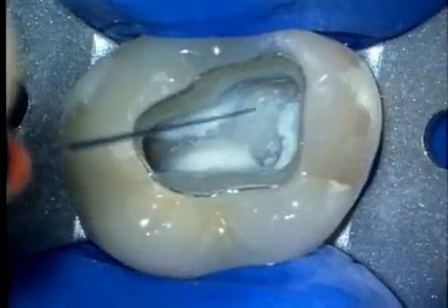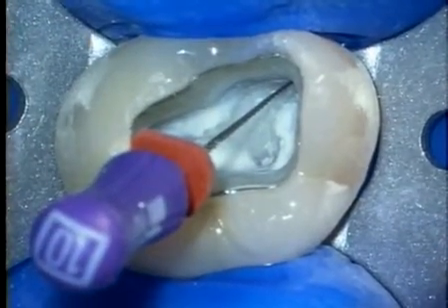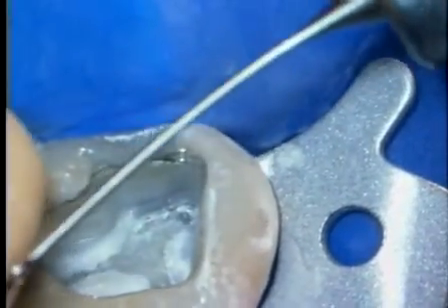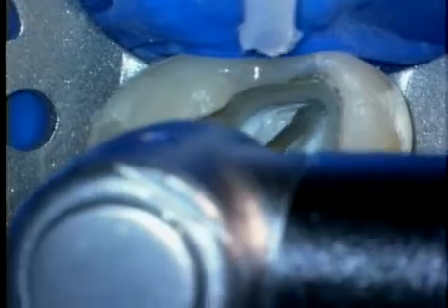Again, a hand file can be used to ascertain the long axis of the canal. Notice how the handle's off axis. Flexible Gates Gliddens can be used like a brush, and we can paint with the belly of the GG to remove restrictive dentin. This is done very precisely and carefully on the outstroke. We can lay the belly over towards the MB2 and refine that area as well.